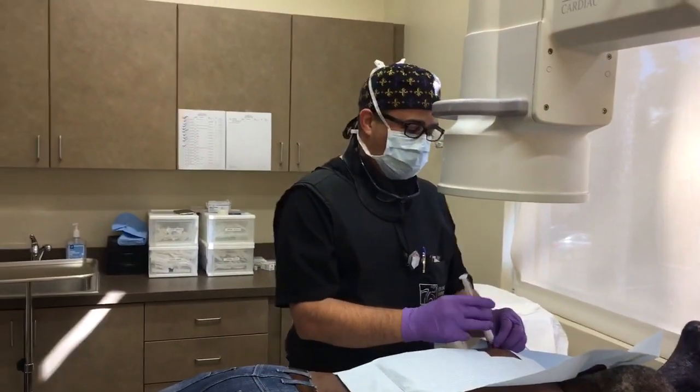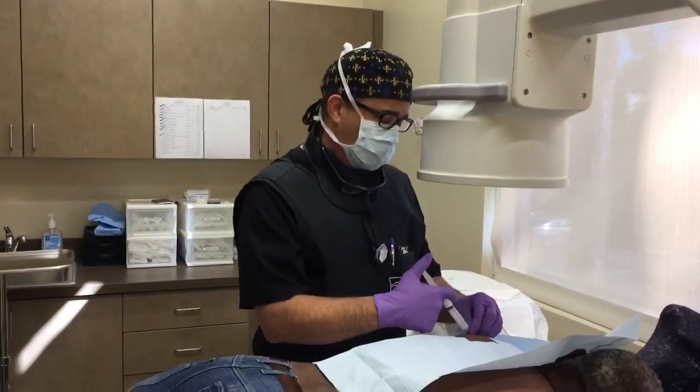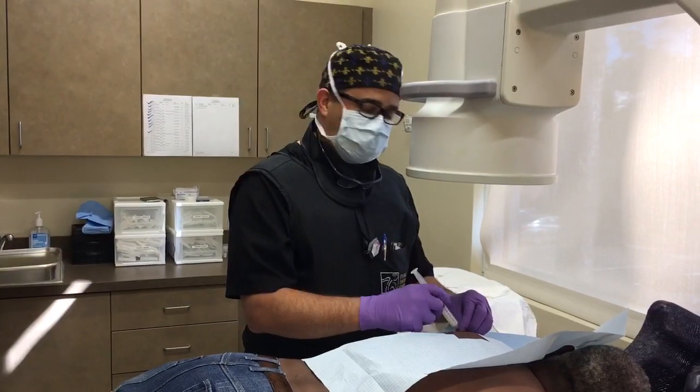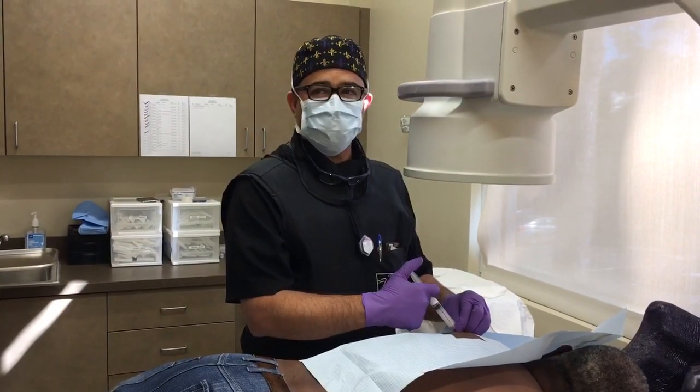And then we'll inject the cortisone, which is an anti-inflammatory medication. Anti-inflammatory medication is going to reduce inflammation and swelling in the joint.